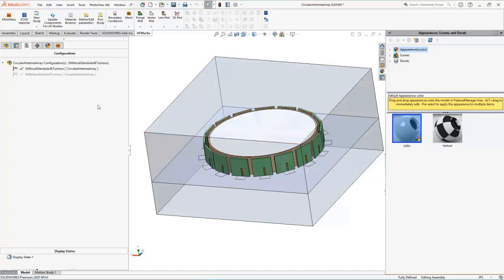If I want to see an alternative configuration, always within the same design, I can just show the second configuration, and here the glandular and tumor are added inside the breast.